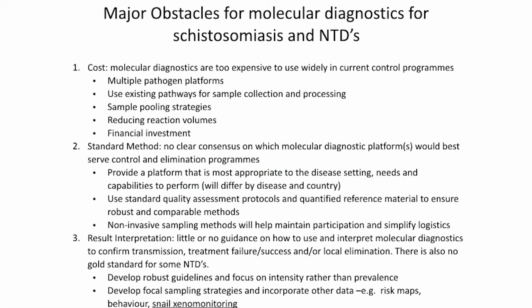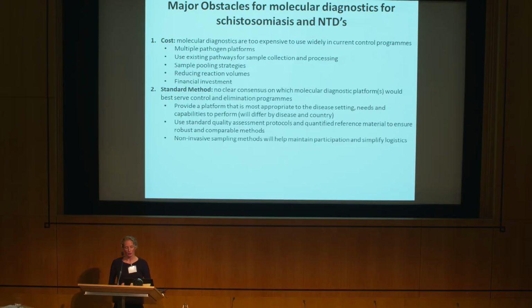There's no clear consensus on which molecular diagnostic platform would be best in a control program, and there's no coordination about that. Some of the solutions maybe provide a platform that's most appropriate to the disease setting and needs and capabilities on the ground. Use standard quality assessment protocols and quantified reference materials to ensure robust comparable methods. Start to think about non-invasive sampling methods, which will help compliance and participation of the people that we are testing, and also simplify the logistics of sample collection.